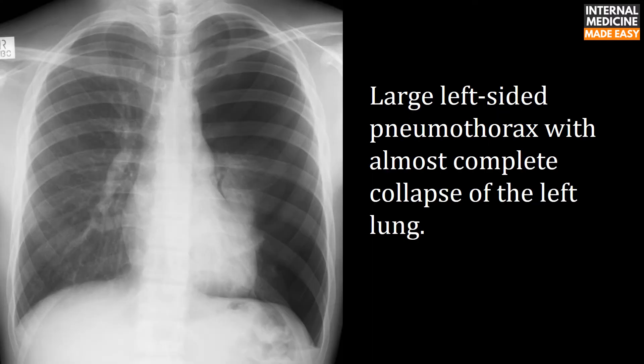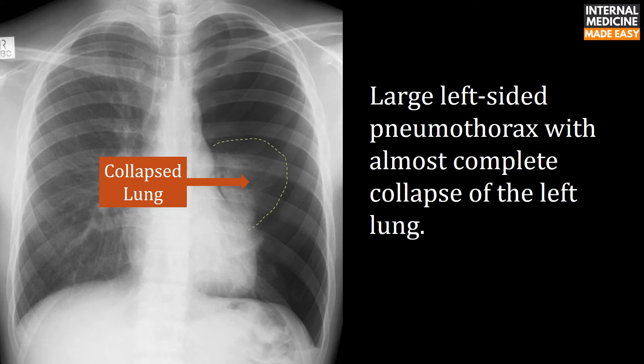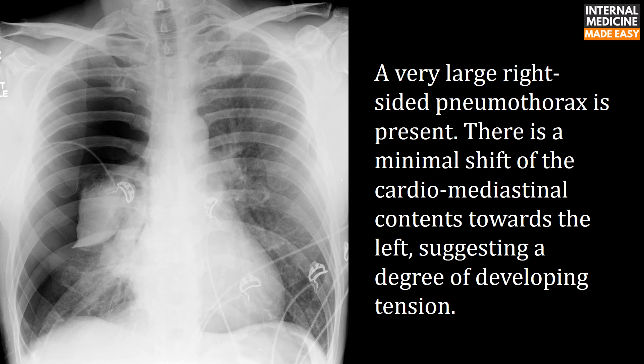This is a large left-sided pneumothorax with almost complete collapse of the left lung. In this next X-ray, a very large right-sided pneumothorax is present, with a minimal shift of the cardiomediastinal contents towards the left, suggesting a degree of developing tension.